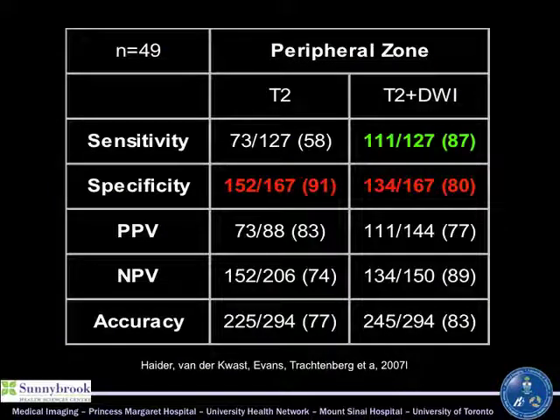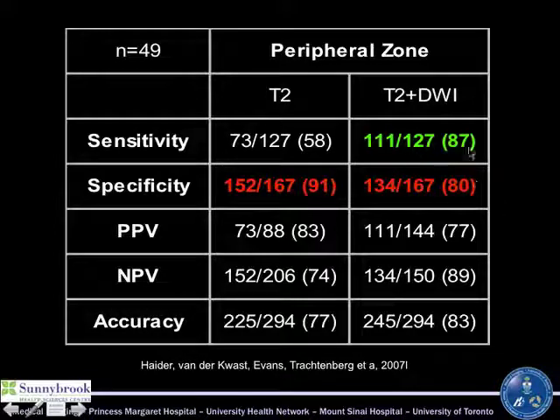We then published work in 2007, and this came from earlier work from the UK and UCSF on diffusion-weighted imaging in the prostate. We did one of the first whole-mount trials of this with John Trachtenberg and our pathologists. What we showed is that, in fact, diffusion-weighted imaging gave us very good numbers for sensitivity and specificity, while maintaining good positive predictive values. And this was a whole-mount correlation study, so optimistic results because all those patients have cancer.